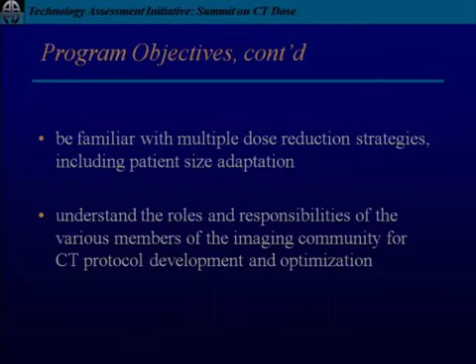We don't think that in general, if at all possible, you get them on your MR scanner. For most of the complaints, you do MR and you don't screen with CT. But for trauma, you're absolutely 100%, I agree with that. It's the major reason that we do CT in children. Thank you. Thank you.